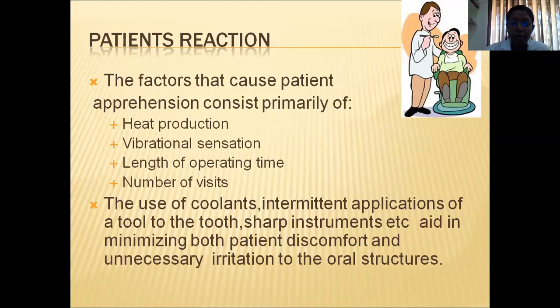Hence, the following 4 parameters must be minimized: the heat production, the vibration sensations, the length of the operating time, and the number of visits. When all these factors are reduced, there is better patient cooperation.